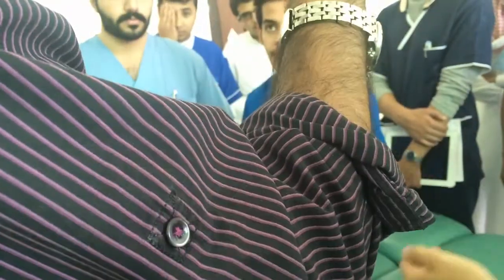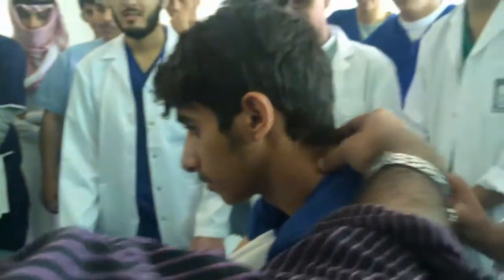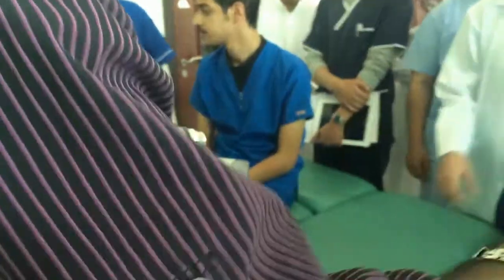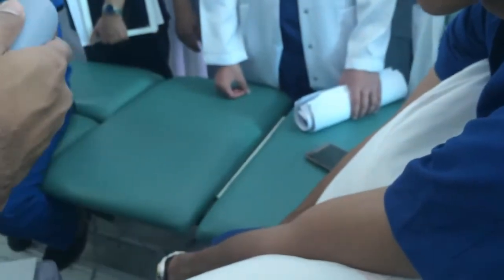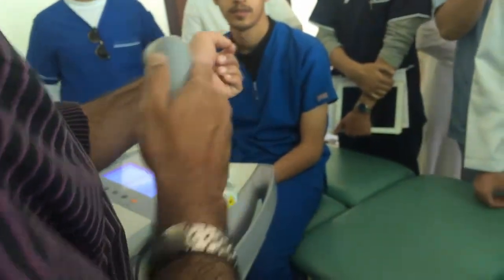The first one is gridding. Gridding means if your patient is coming with a large area of pain, divide that into small grids. Understood? If your patient is coming with any kind of open wound and this laser has only one beam, then scanning. I'll keep 5 to 10 millimeters away from the skin and I'll keep scanning.